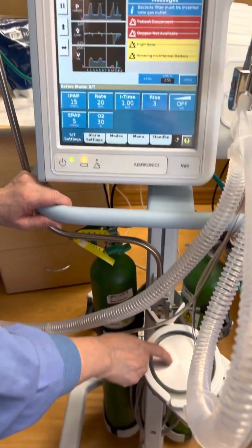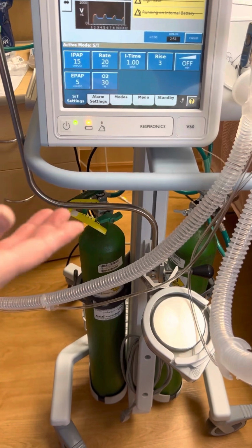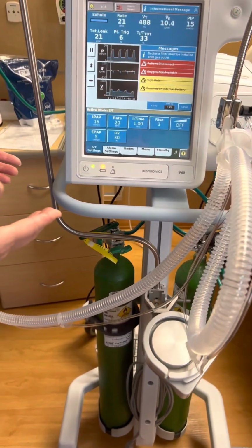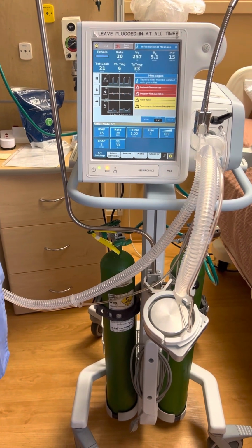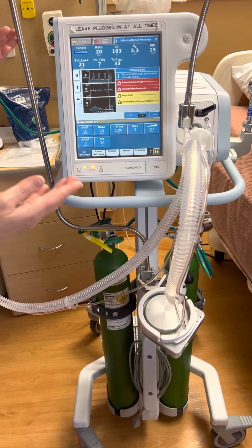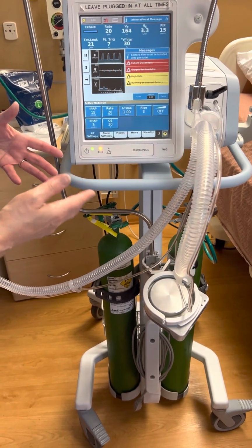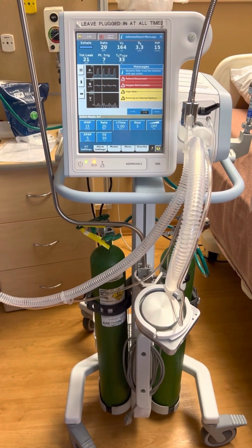This machine, one of our BiPAP machines, has a heater on it if we choose to use it. I'm the only one that sets that up. Don't ever worry about it. If it needs to be done, I will take care of it. And at that time, I will report to that nurse exactly what to watch for. Basically, we hang a water bag. It's got a self-float, just like what the Airvo or anything else does. It's super easy to deal with, so I will worry about it at that time.